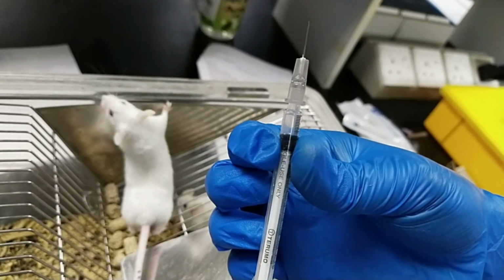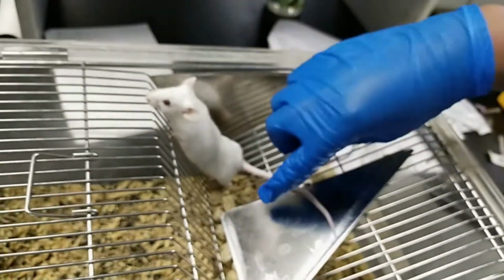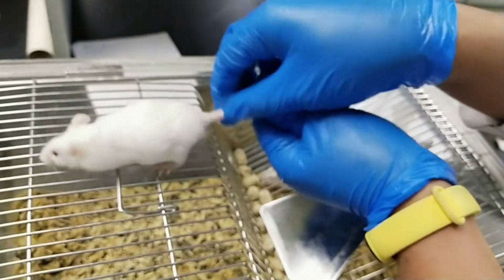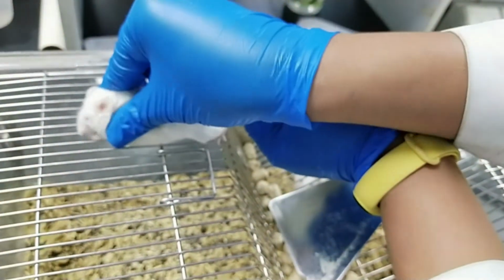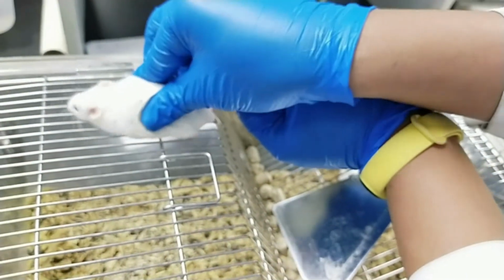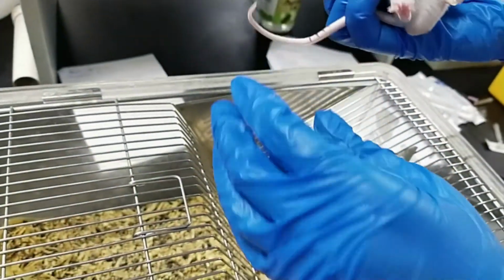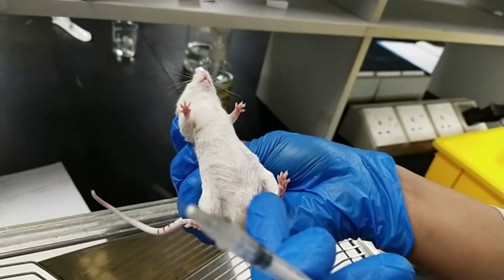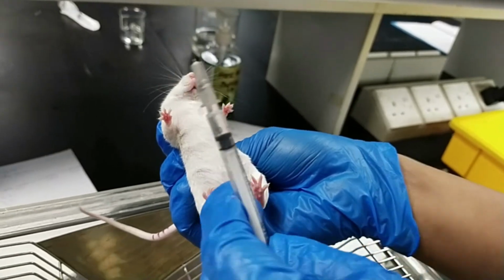Okay, so the volume needed for injection is 0.14 ml. So next we're going to proceed by grabbing the animal using the same method as the previous injection. Okay, so for the IP intraperitoneal injection, we're going to inject it at this area, at the peritoneal space.